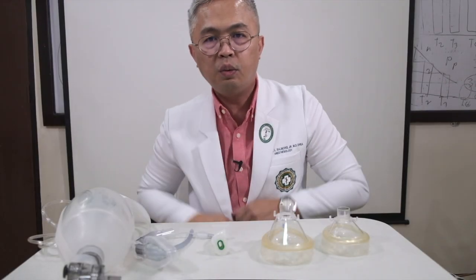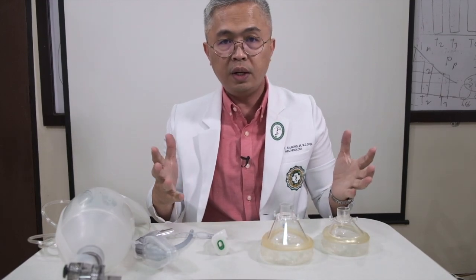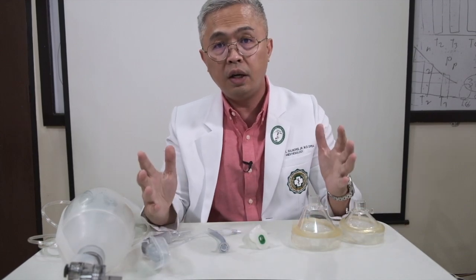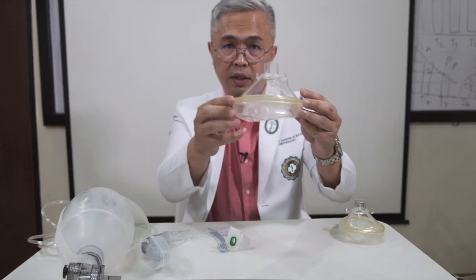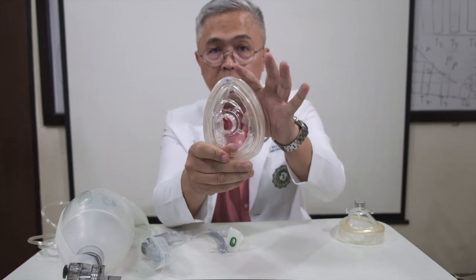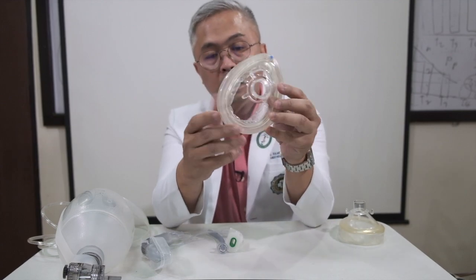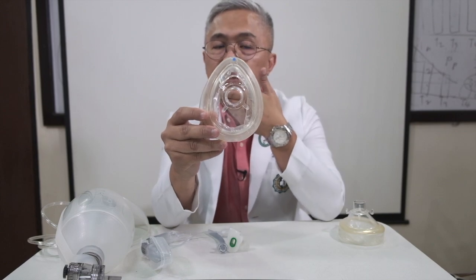All right, so we're here in our office. Right before me are the different tools that we use to mask ventilate our patients. So we'll start off with the face mask. This is an adult-sized face mask. This is the nasal area. It goes to the bridge of the patient, the nasal bridge of the patient. This is the mandible area. It goes to this part of the patient's face.